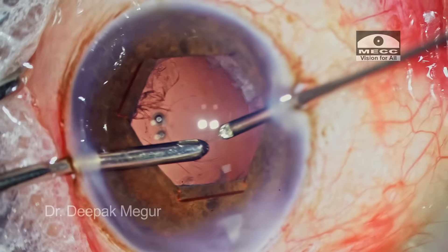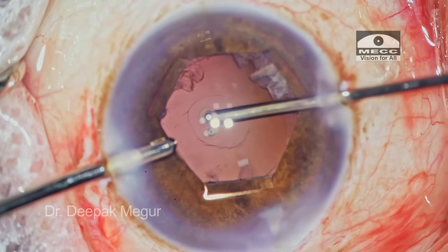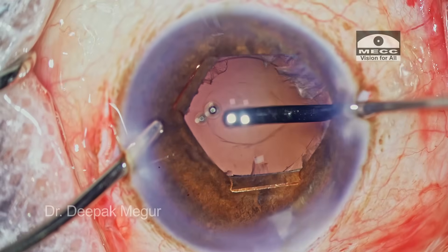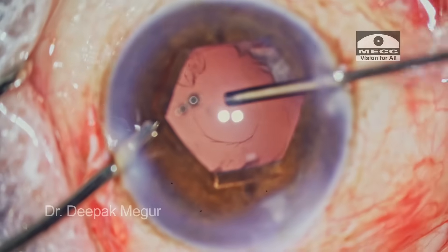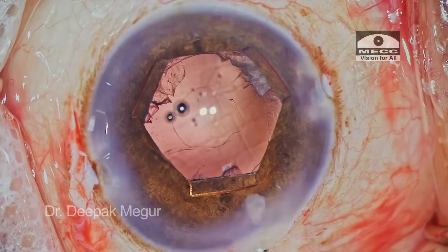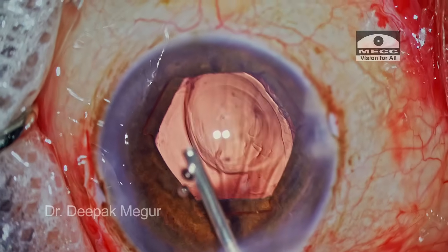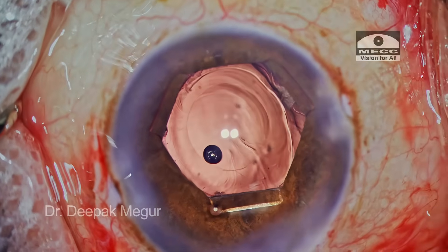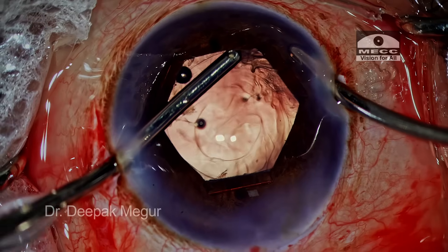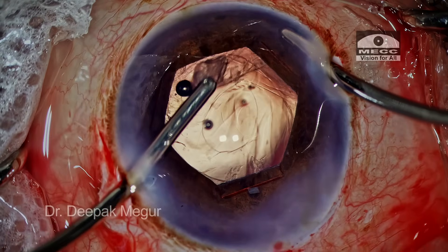Since the fragment is held at the main tunnel area with no risk of falling down, I go back through the side port incision to deal with the prolapsed vitreous fibril. Once that prolapsed vitreous fibril is taken care of, the shape of the posterior capsule tear changes — it becomes very circular, just like a rhexis, because there is no fibre tugging at it. Once certain there is no more vitreous, I put in some OVD and burp out the small nuclear fragment from the wound. Now we have no nuclear fragments inside the vitreous cavity — time to remove the cortex using the bimanual irrigation-aspiration system with vacuum of 200 and flow rate of 20.